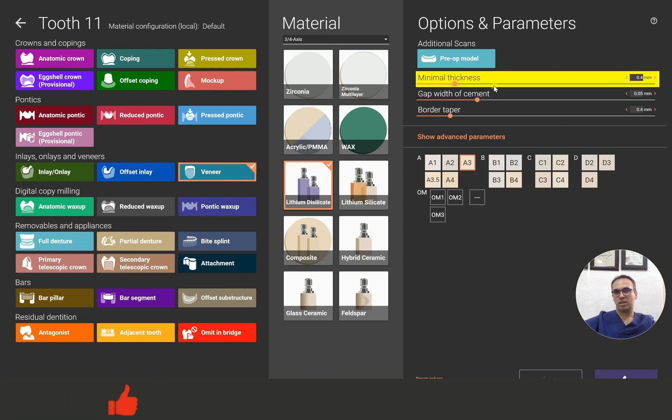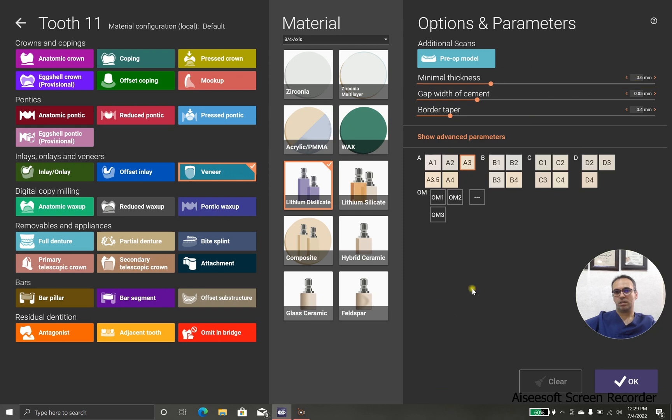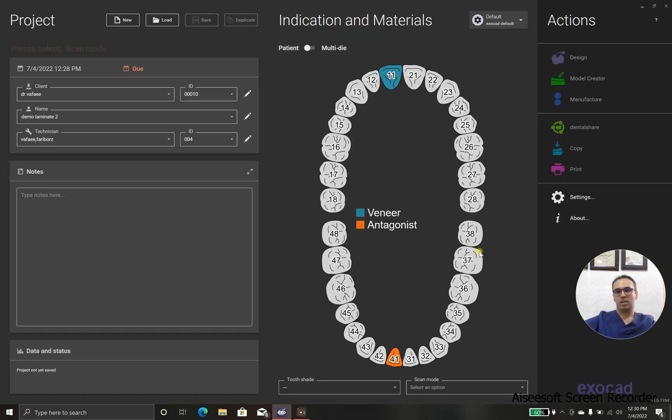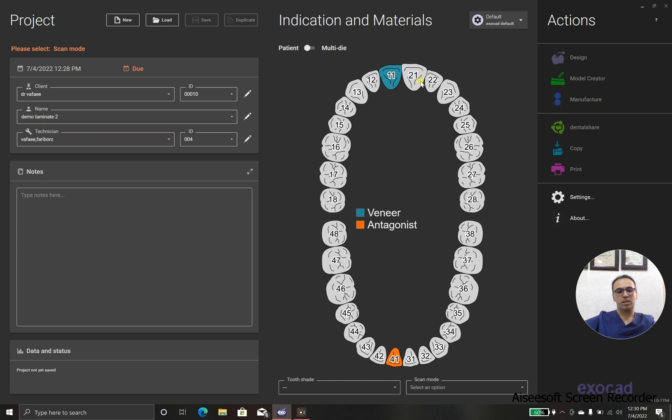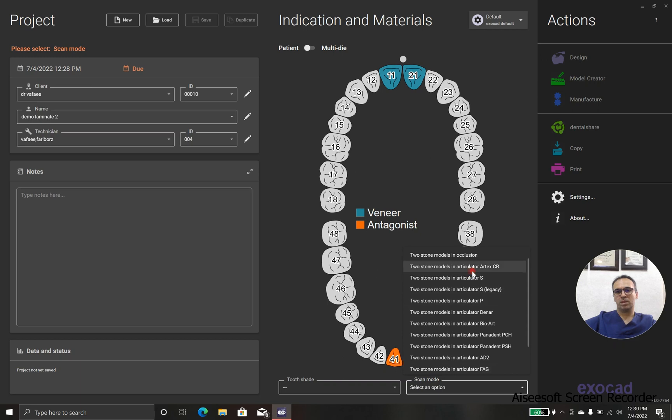And as you can see, in case that I reset it, it goes to 0.6, but I prefer 0.4 because I have good results with 0.4, and we have two laminates in our demo.